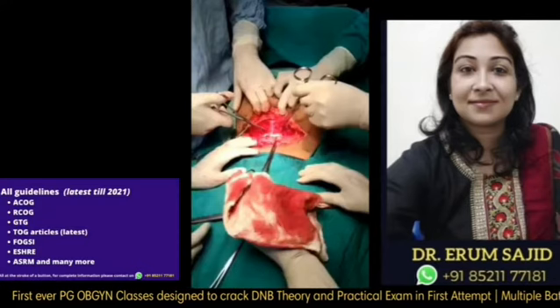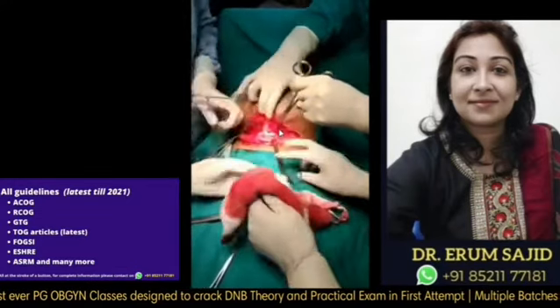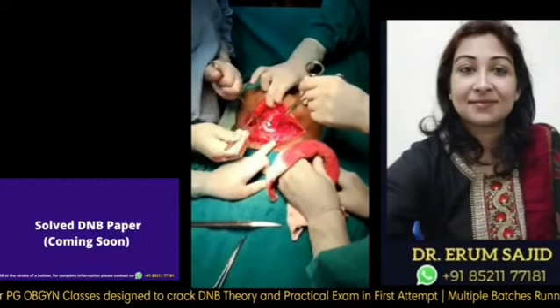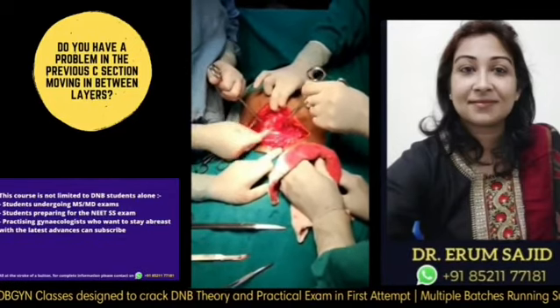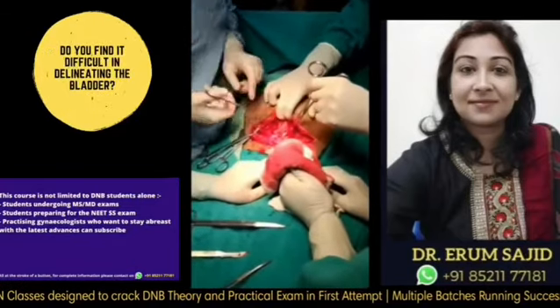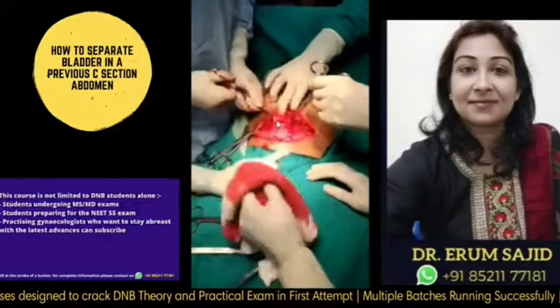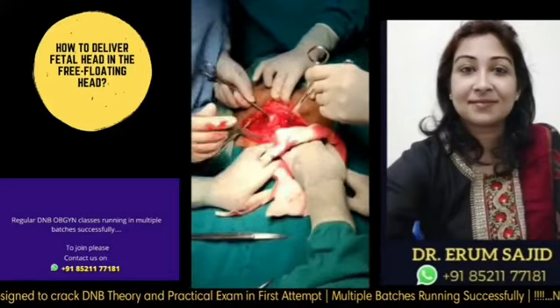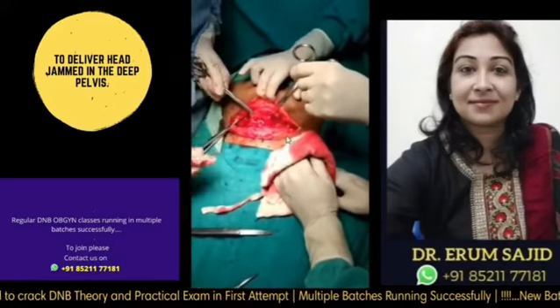Now I try to give some traction over here. Why am I giving the traction over here? Because I want to pull the peritoneum up, so that anything from below, maybe the intestines or the omentum, or sometimes even the bladder, sometimes even uterus, is stuck directly under the peritoneum. This was a wrong movement, in the sense I was just giving traction, so the muscle belly sometimes gives way. Again, muscle bleed is very bad, so be very, very gentle. I'm asking my assistant not to help me here, because she cannot do anything. If she gives more force, it will be more harm than good.